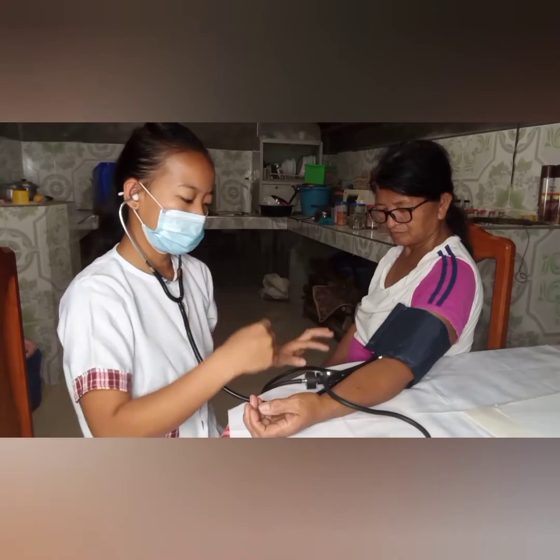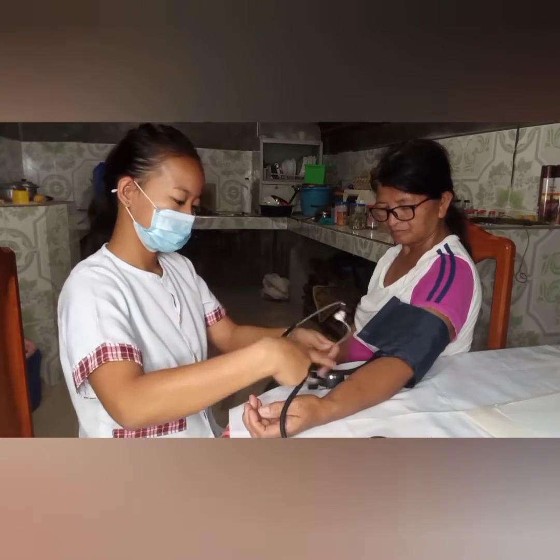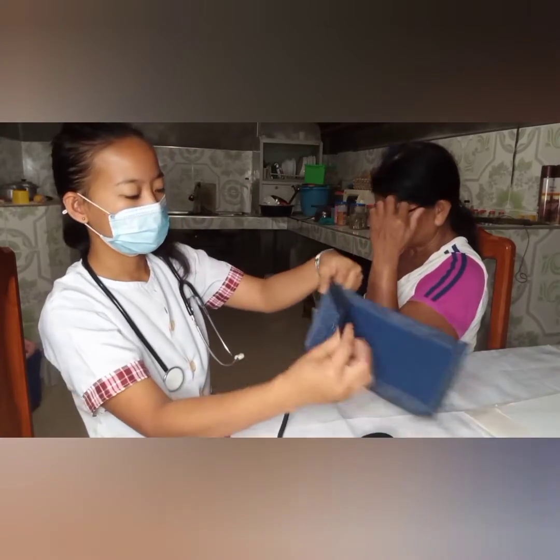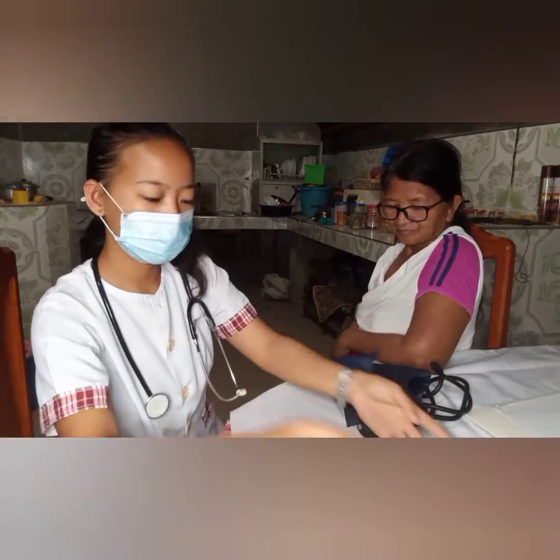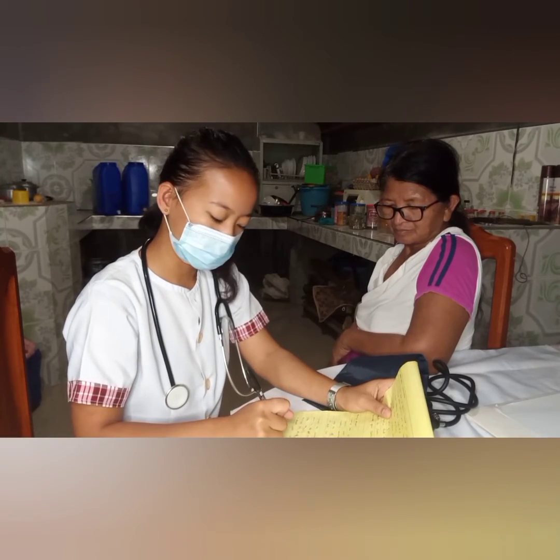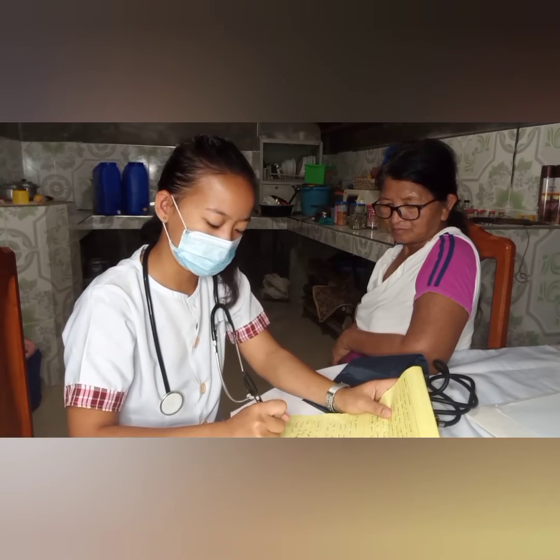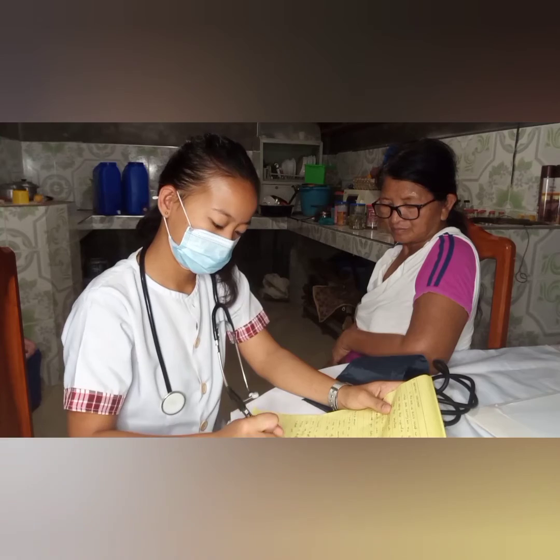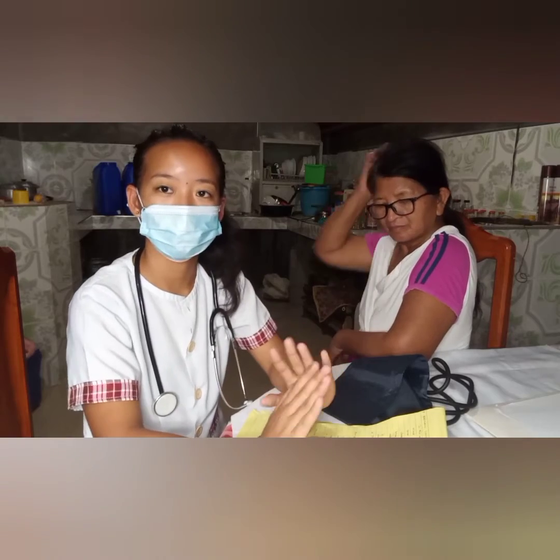After that, we are now going to remove the cuff of the patient. We have to remove this first. And we are now able to disinfect or clean our paraphernalia. After that, we have to keep our data on our chart, and do not forget to put all the details that are necessary for the diagnosis of the patient. So that is how we get the blood pressure of the patient.